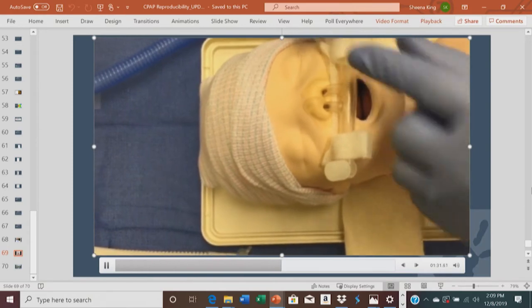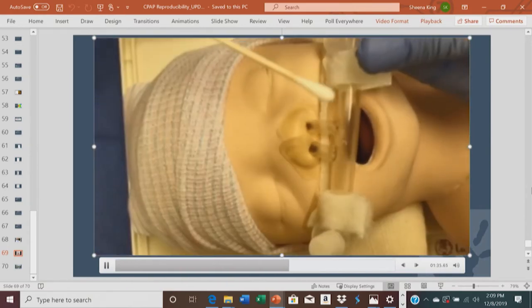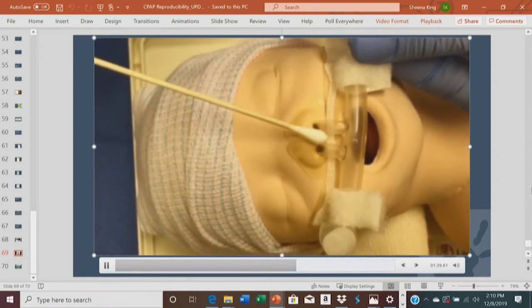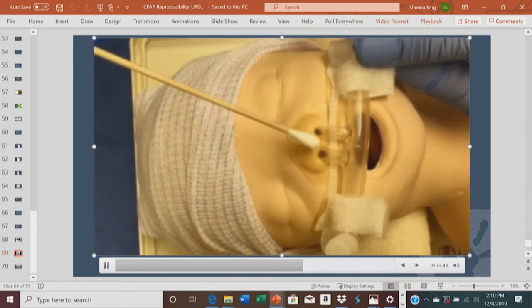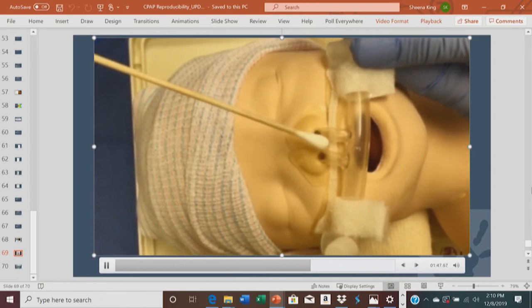To confirm whether the application is correct, look at the nose from above. You should see a wide four to five millimeter space between the bridge and the septum, as well as a visible one to two millimeter space between the upper edge of the velcro and the base of the nasal septum.